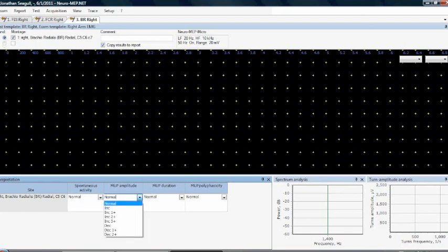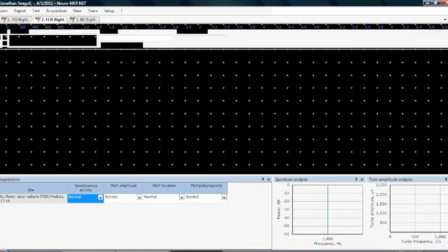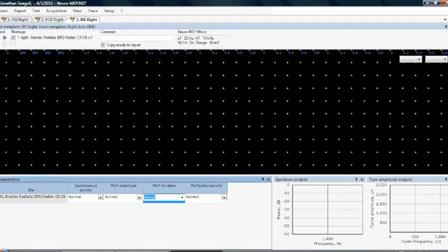Same thing here, increase 1 plus, 2 plus, 3 plus. It's going to show me all of these things right now. Everything that I change is going to appear in that. So because in the first two I had not implemented it, obviously it doesn't show me that. But now if you close this and reopen it, every single muscle that you're going to do is going to show you the changes that you've seen before, that you have implemented before. And that's how it is.